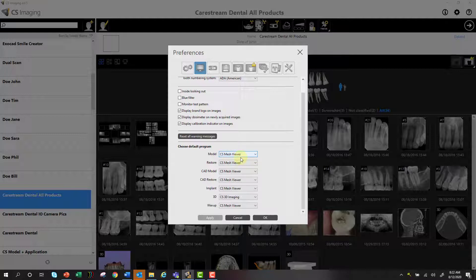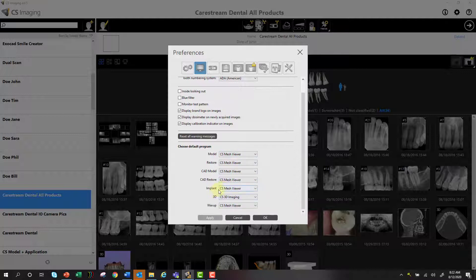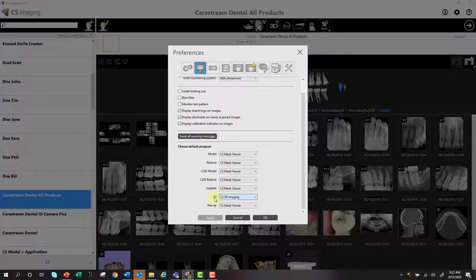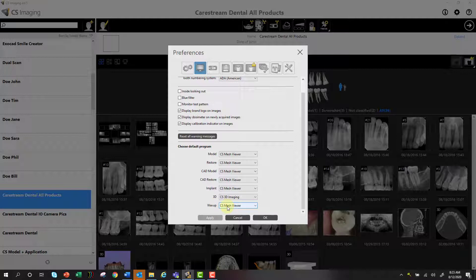I generally prefer to have Mesh Viewer on all of these items. And you'll want to change the 3D from CS Imaging, which is the default, to CS3D Imaging. If you don't have CS3D Imaging installed, then you're not going to see that option there. Same thing goes for Mesh Viewer. And this is also a newer version of CSI 8, where we have a wax up where you can import any STL file from any digital impression scanner and have it launch Mesh Viewer as its default viewer.